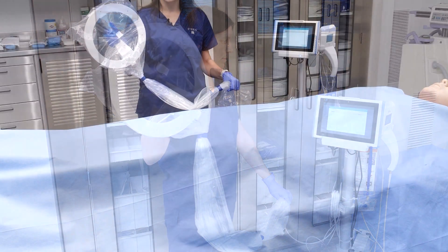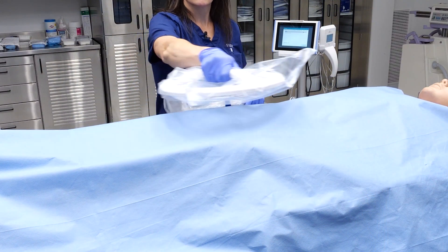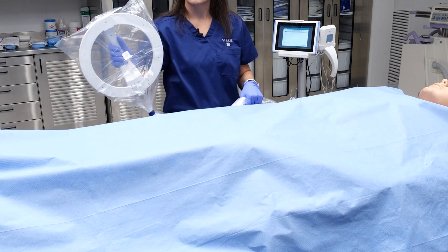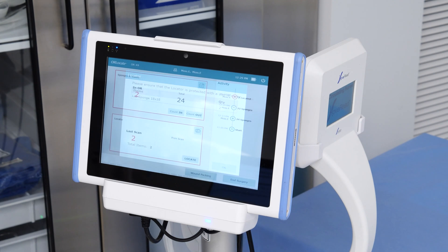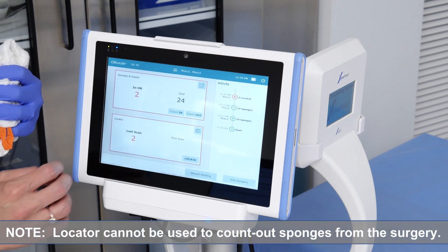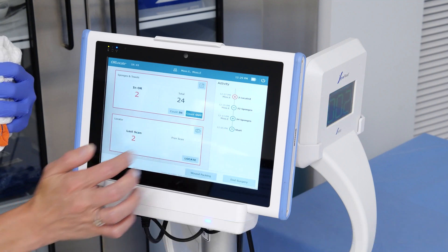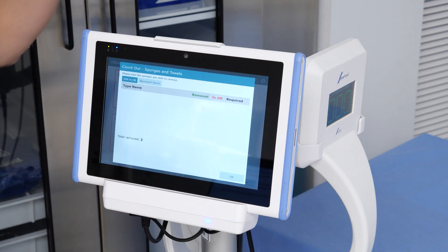When a sponge or towel is located, an audible beep will sound from the locator wand. Once the sponges are located, you need to count them out with the HOVREED. This is an important step because the locator will not count out sponges but only locate them. Repeat the previously discussed step to count the missing sponges from the surgical case.